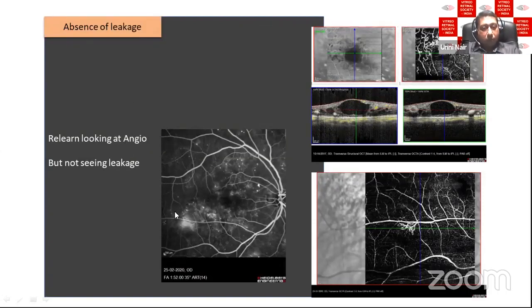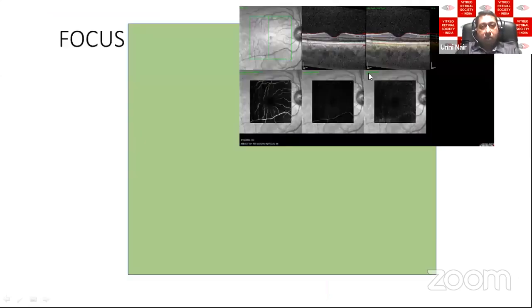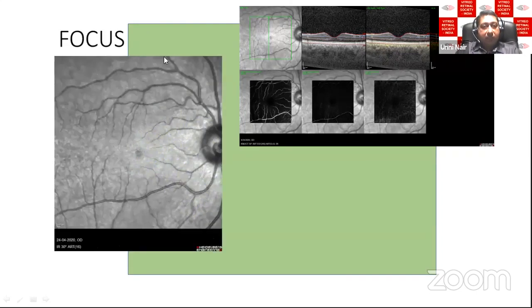We also need to relearn how to look at leakage. On a typical FFA there is visible leakage, but on OCTA you only see the vascular elements — there's no leakage on OCTA, just the collateral formations and a disturbed macula. For acquiring the best image: always start with an infrared reflectance image, ensure the eye surface is moist, know the area of interest, and keep the RPE as horizontal as possible.